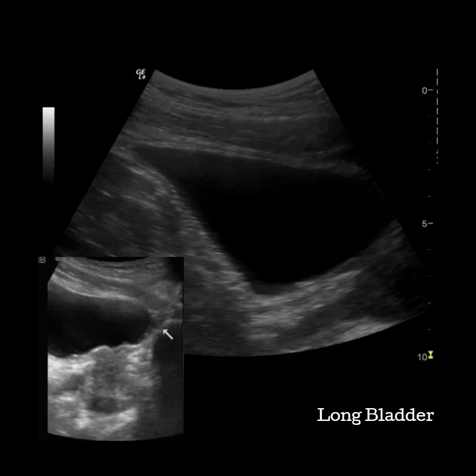Once you've identified the transverse bladder, turn your transducer 90 degrees and sweep side to side and look for where the bladder is longest. For many people this will take on a triangular appearance. If the bladder is empty, it might be more helpful to identify the pubic symphysis or the pubic bone — it is a shadowing structure on the inferior border of the bladder.